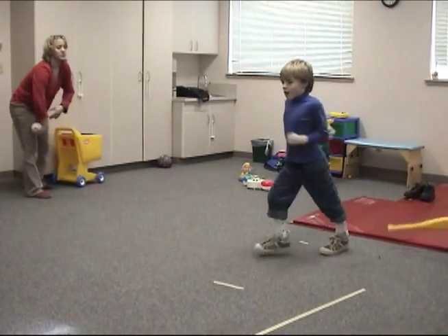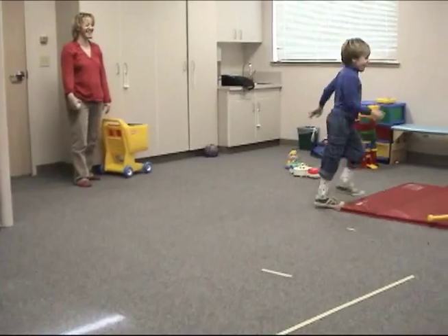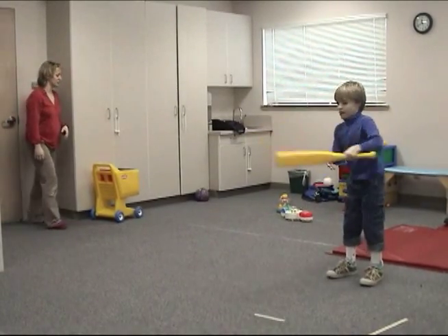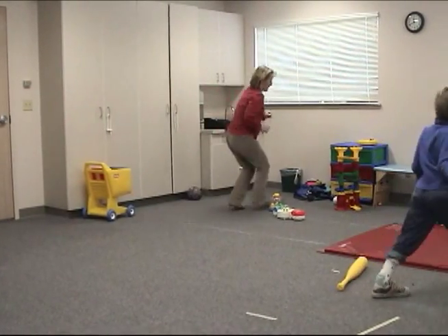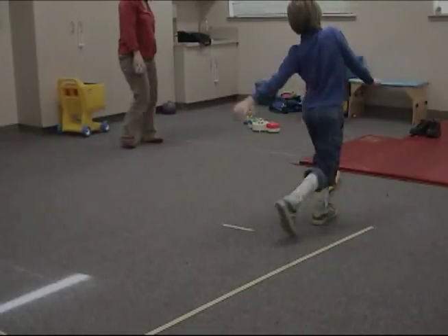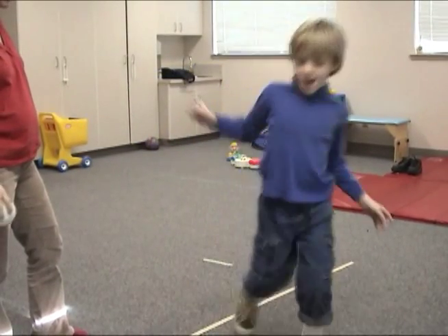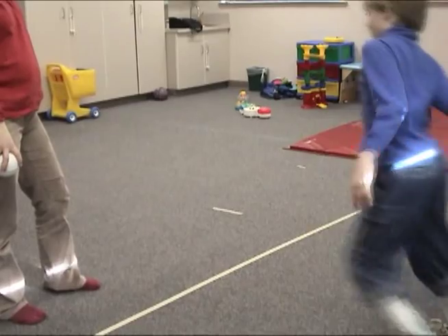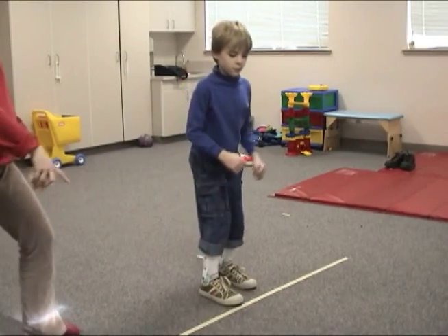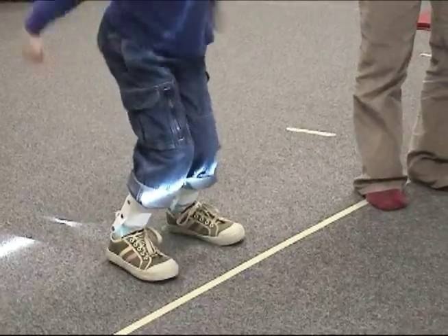A similar activity is required of him in playing baseball, which actually has more of a dynamic quality in that the therapist has him running bases in circles to the left and occasionally to the right. She also has him doing a jumping game, which requires very strong plantar flexion and knee extension and hip extension to generate the ability to actually jump off the floor.